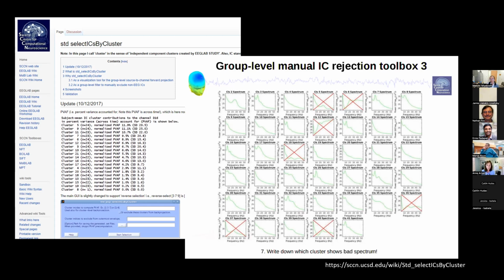And if we see a power spectrum density that goes against such a pattern, so for example, this cluster 5, well, this is actually okay, but cluster 6 looks like a square root sign, and it doesn't follow the 1/f, then we can simply say that because the power spectrum density does not follow the 1/f pattern, we declare that this is not representing a pure brain signal. It's a very simple and convenient criterion we can use.